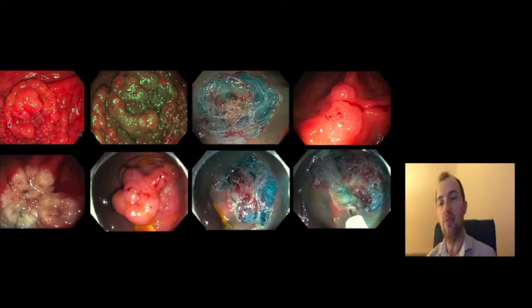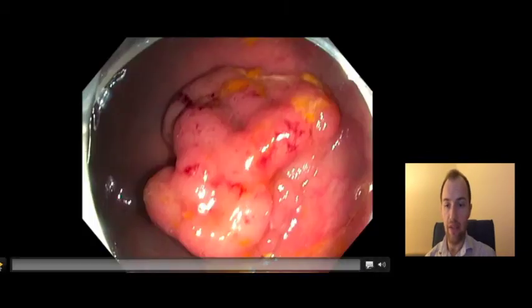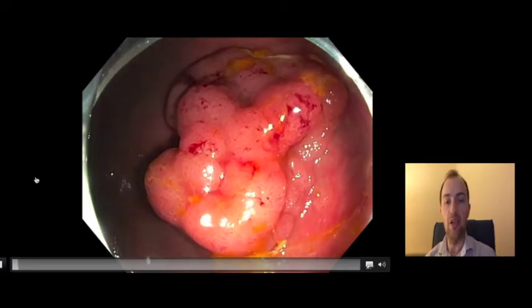Just a note to say that it is possible to resect fully circumferential lesions if the patient has had a previous appendicectomy, and we demonstrate some of these and the technique in the paper. And I'd like to show you this video that essentially consists of one such lesion.